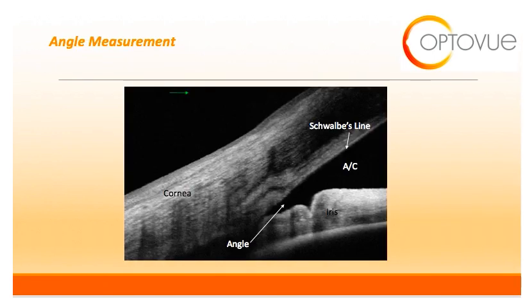Let's switch over now to the anterior chamber angle. OCT can be extremely useful in assessing the anterior chamber and can provide supplementary information on this very important structure. The angle is the area spanning between the cornea and the iris, and here you can see the anterior chamber and Schwalbe's line, which is the most posterior portion of the corneal anatomy.